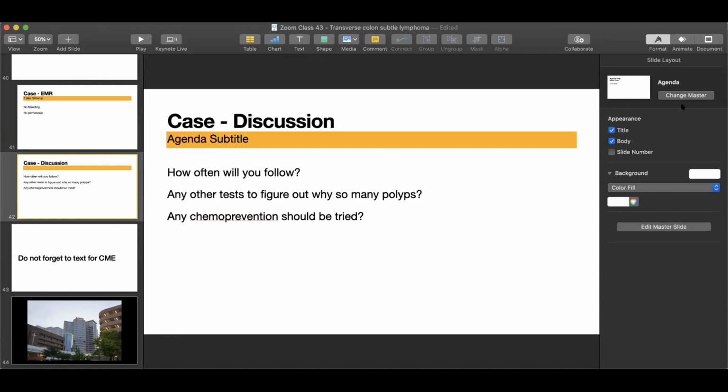The patient will be very uncomfortable, and you will also be uncomfortable because you are so concerned about whether you're going to perforate or not. Then the whole exam becomes not very useful. But you need to have the right colonoscope. I'm not getting any royalty from what we contributed in the field on that.